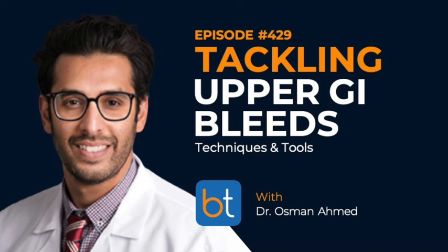Yeah, I'll do power injections. I think there's a lot of value in power injections, like you've sort of mentioned, because we're looking for a bleed. So you really want to give a good bolus of contrast at a high pressure to identify where this tiny little bleed may be coming from, because more often than not, your body's trying to treat that bleed by spasming the vessel and trying to cut the flow off. So you may need to sort of force contrast down the throat of that vessel to identify it.